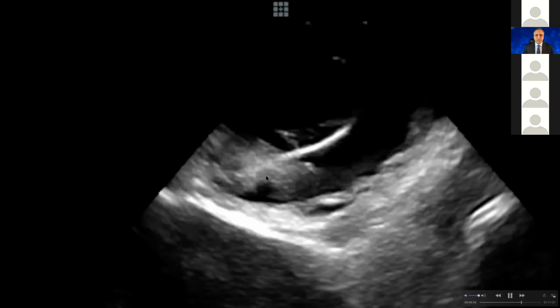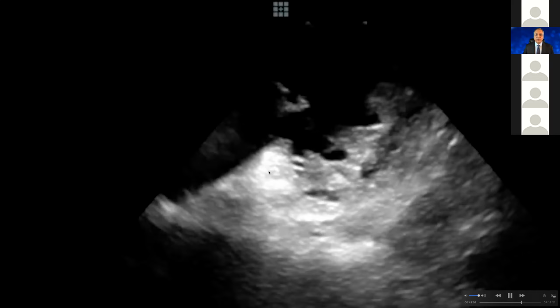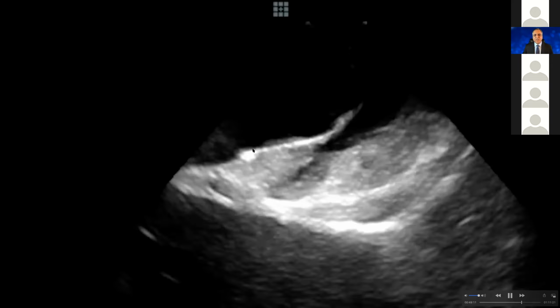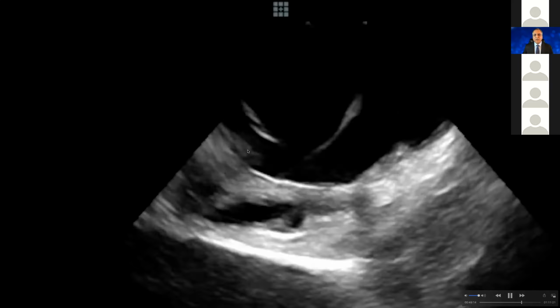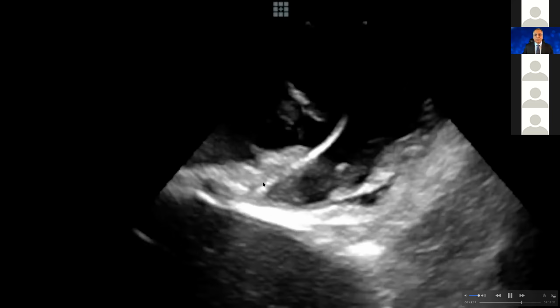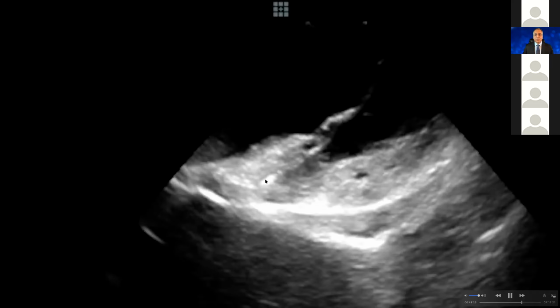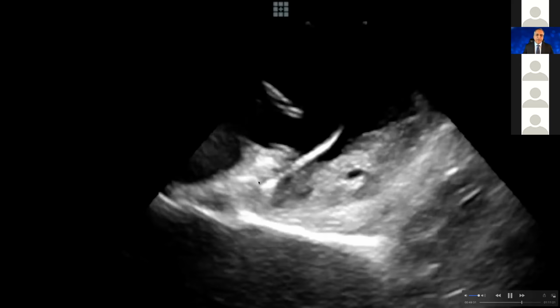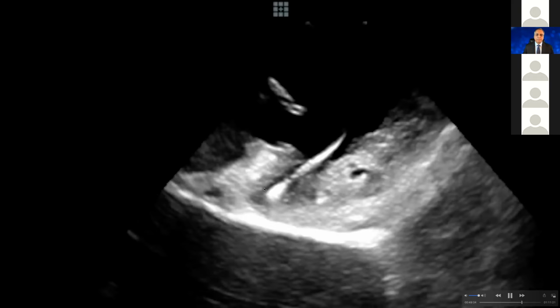You can see the ablation is right under the valve, right there. And here you can see ablation actually came to the right atrium. You see? Then you say, oh, I just saw that atrial activity. Yes, because the ablation just came to the atrial side of it. I release the curve, go back, and go inside the right ventricle under the valve. So this is the right atrium. This is a valve, right ventricle, and I'm right under the valve. And this PVC was, interestingly, coming from this very area, which was lateral part of the RV, right there.